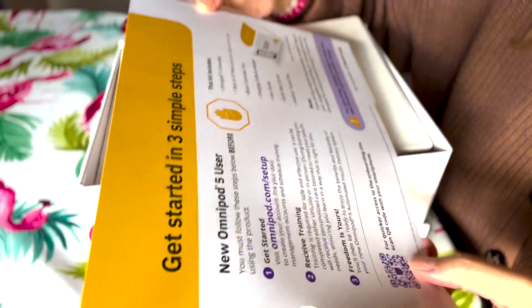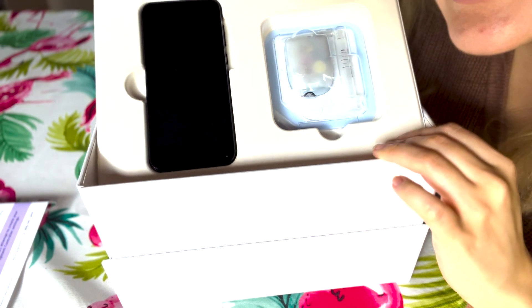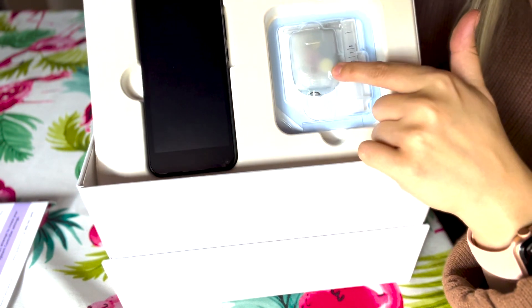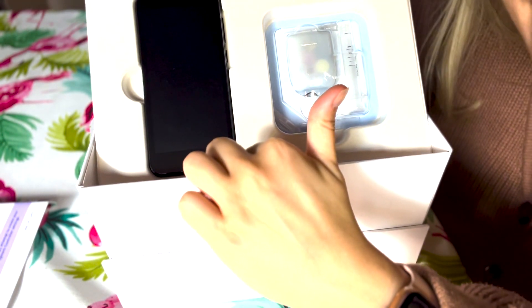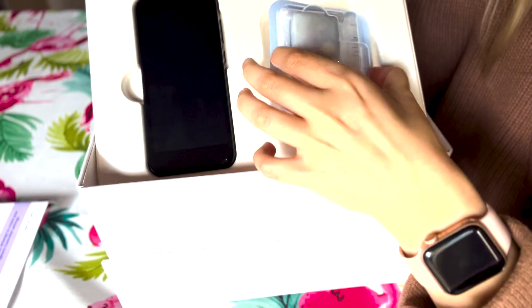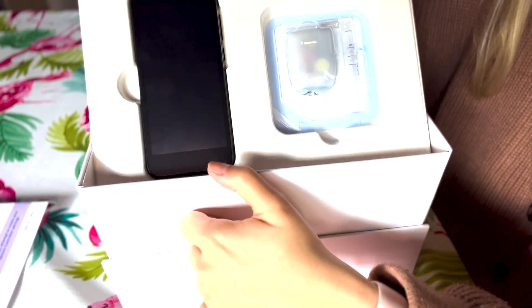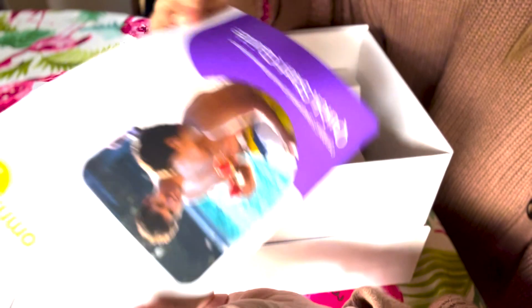It comes with this 'get started in three simple steps' guide, which I like because I am not in the mood to spend a lot of time on this. There's going to be an Omnipod 5 pod and the Personal Diabetes Manager, or PDM — basically it looks like a little Android phone. The pod looks even tinier than the Dash. I have some Dashes so we'll compare the size. Quick start guide, and extra pods.